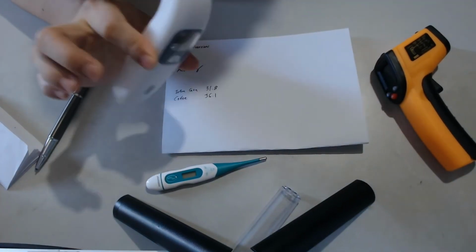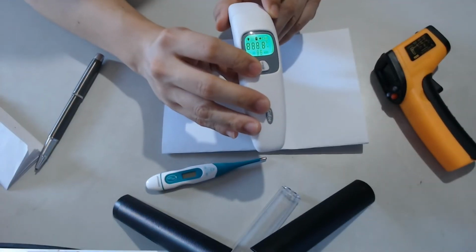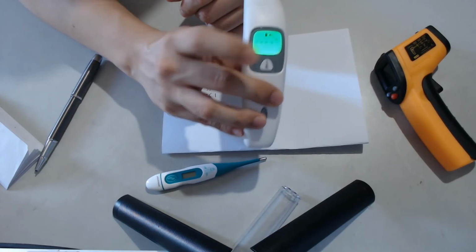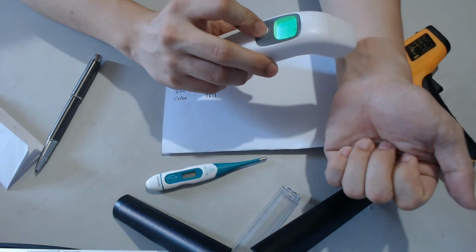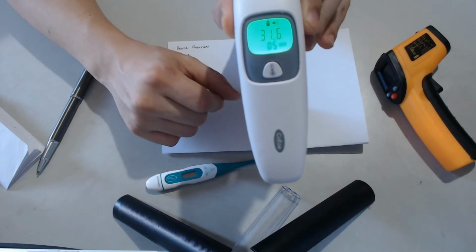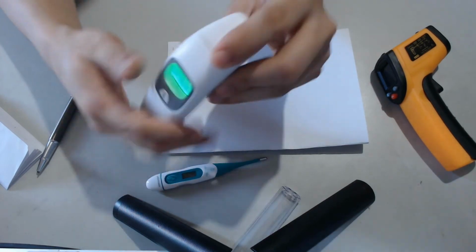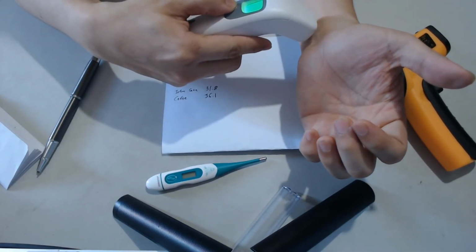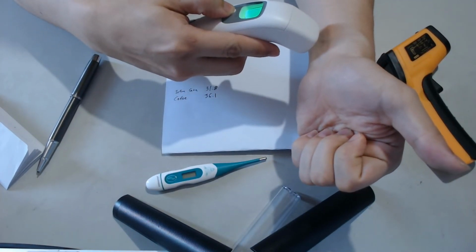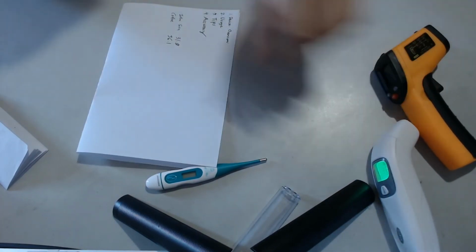However, remember the object measurement mode that I was talking about? Let's switch it. Open it. 1, 2, 3. There. 31.6, which is more 32. 32.6. 32.3. So let's say it's 32.